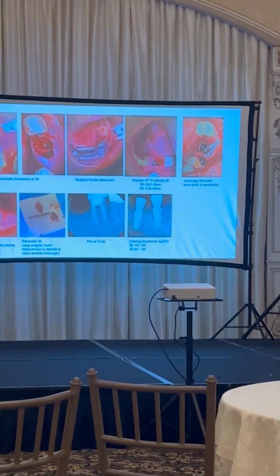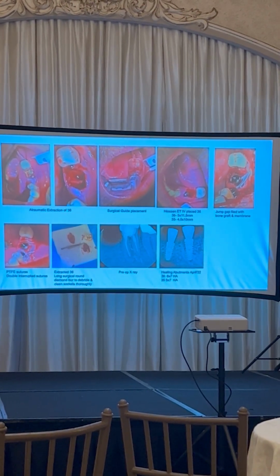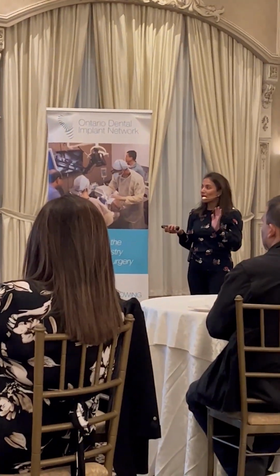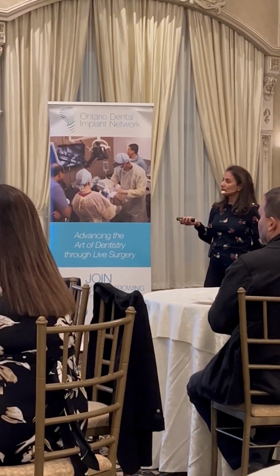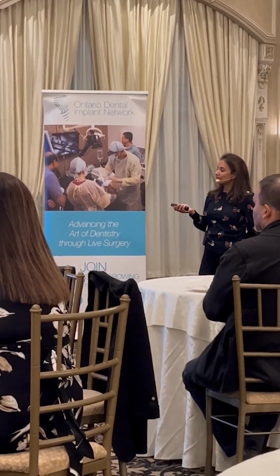I love using the long surgical round diamond burs to debride and clean the sockets, just like one of our colleagues said. Clean, thoroughly clean until you see real white. So that's what I did. The pre-op x-ray over here, where the 3/5 implant went in, the 3/6 that was extracted, these are the two implants with the healing abutments.